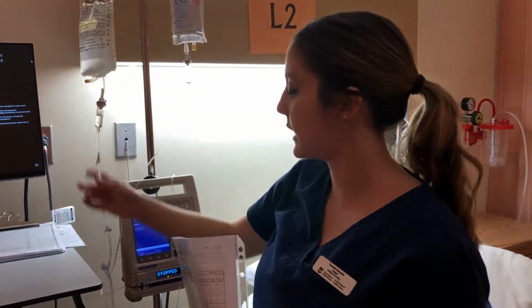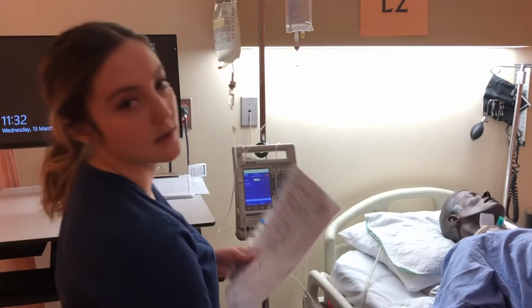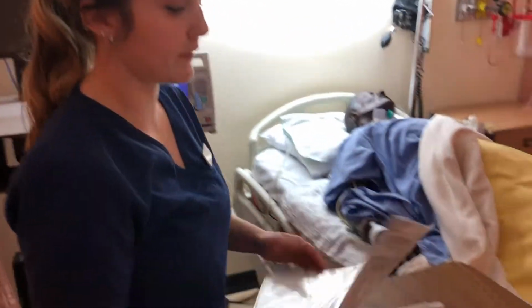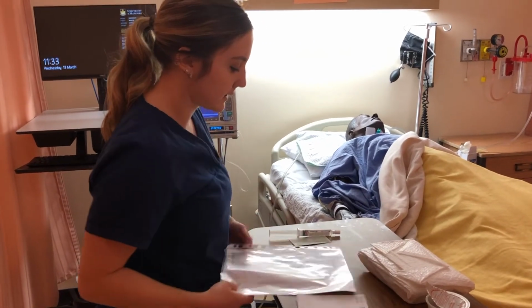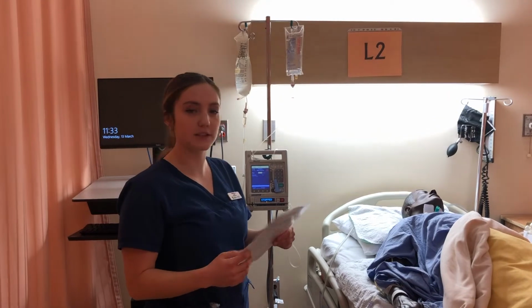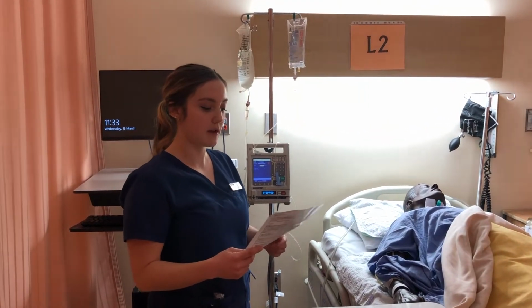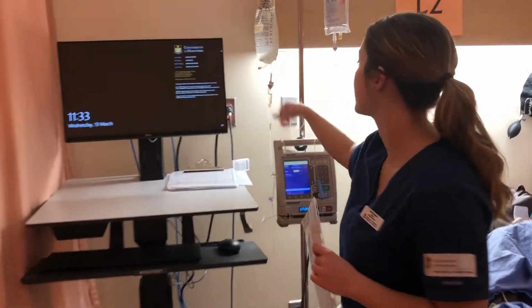So, noting that this is not expired, it's running via gravity rate, so I'll just confirm the rate by counting the drops per minute. But for video purposes, I'm not going to do that. So I've calculated, since I have to administer this at 1350 units an hour, my rate will be 13.5 mLs an hour, so that's what I'll be programming into my pump. So I've done my first check.